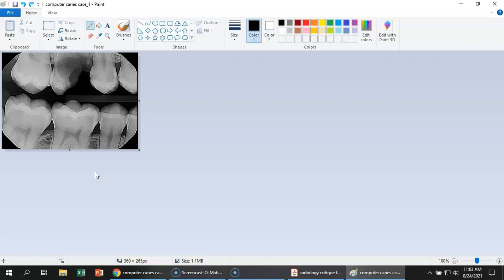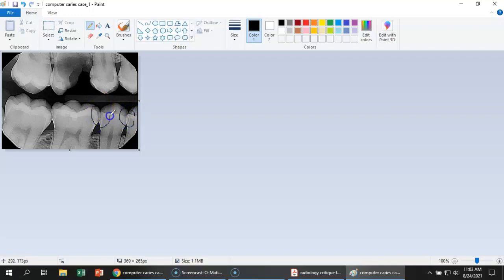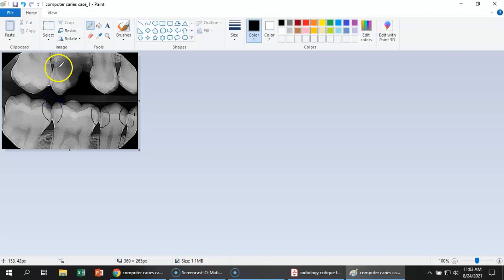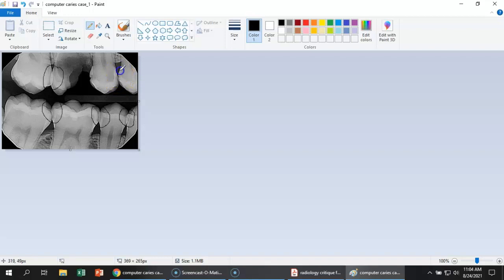What about horizontal angulation? Do we see horizontal angulation? Yes, we do. We can see that these two teeth are overlapped here. We can see that these teeth are overlapped here. We can see that these molars are overlapped here. And they are overlapped here. They're even ever so slightly overlapped here. So we could even count that, even though it's just barely.